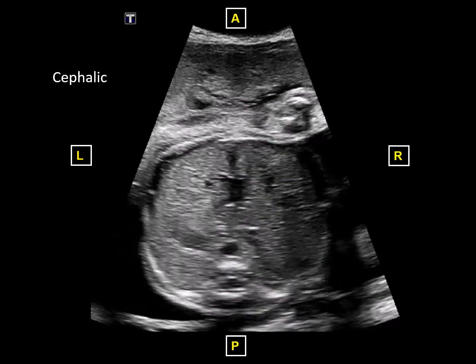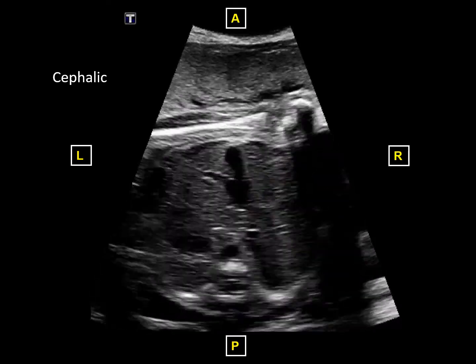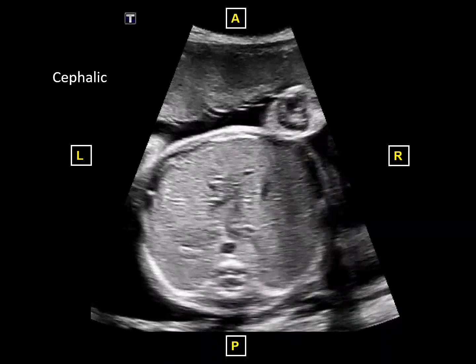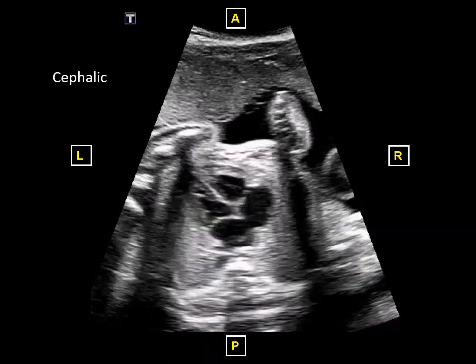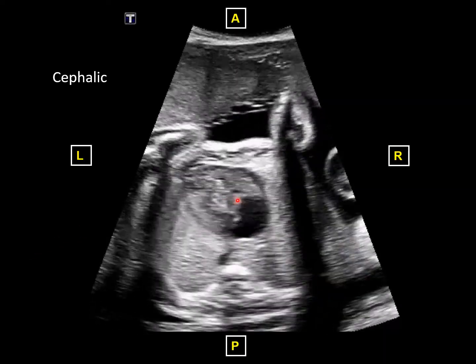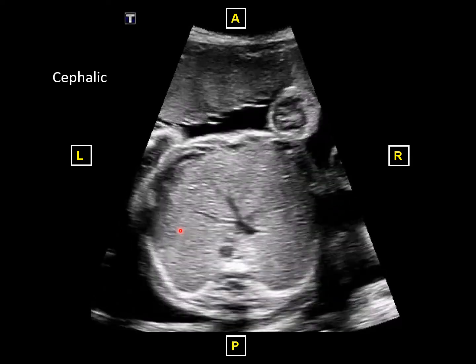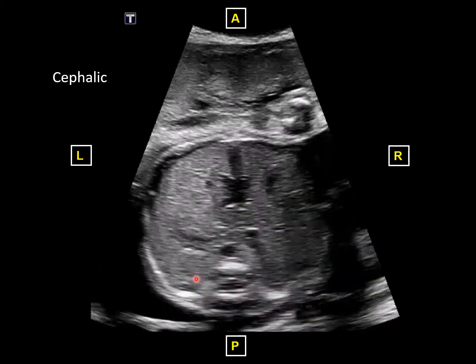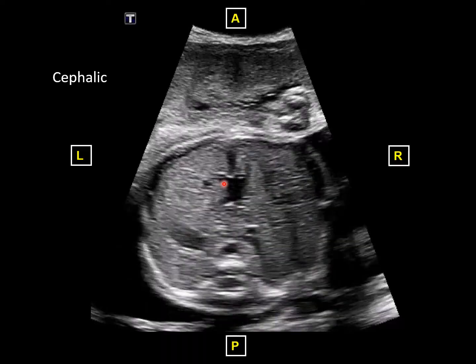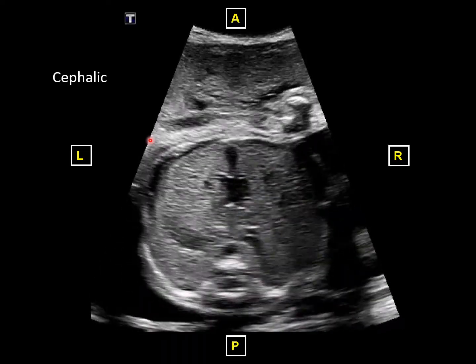And so here we are in this transverse abdominal view, this fetus that's in a cephalic presentation. You can see here in the beginning of the sweep, we have the portal sinus here with the umbilical vein, joins the hepatic veins, joins the IVC. You have the stomach here on the left, the spleen is behind the stomach here. And then if you look as we sweep up into the chest, the cardiac mass, the apex is pointed to the left in the patient.